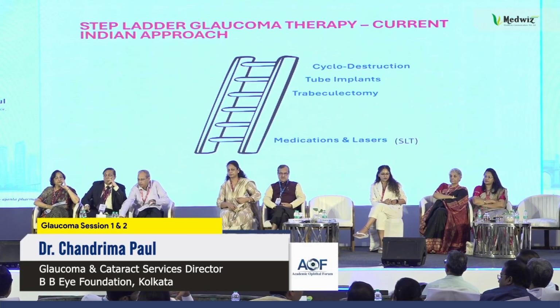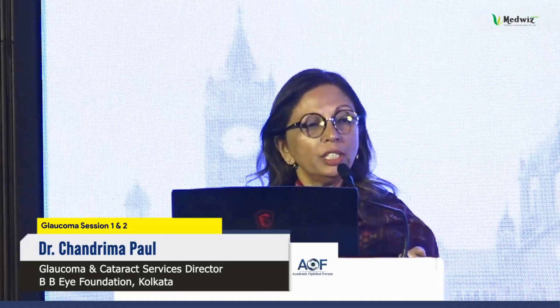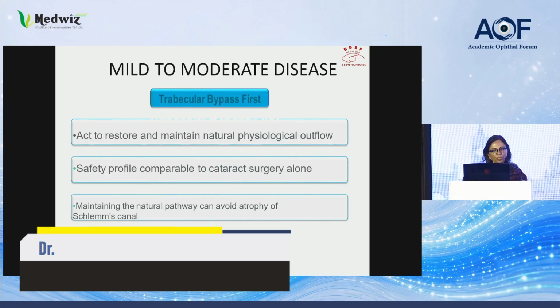And this time I'm going to take you through MIGS with a stent, and I have no financial interest. If you look at the ladder of glaucoma therapy, the current Indian approach, the gap you see after medications needs to be filled up with MIGS, minimally invasive glaucoma surgery.